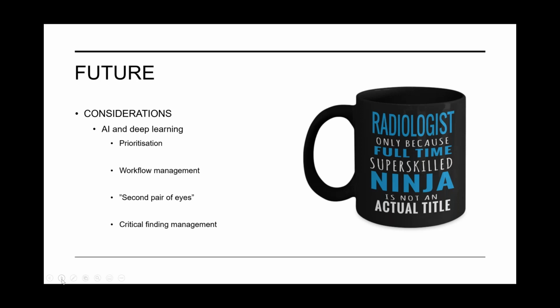And also with critical finding management, it could become less of a manual task and potentially risky if an AI tool was there to pick up terms that are used and to flag them up instantly to the referrer.